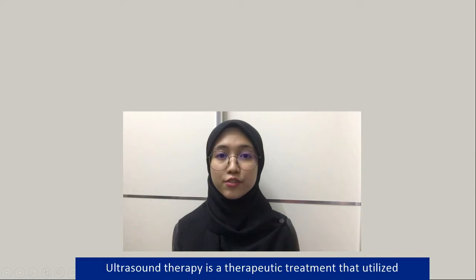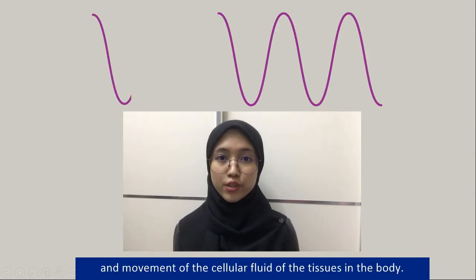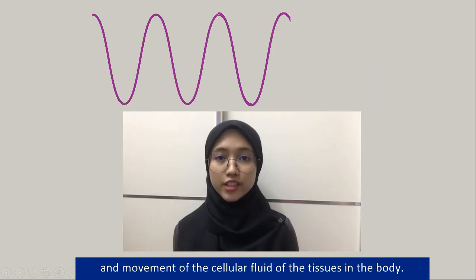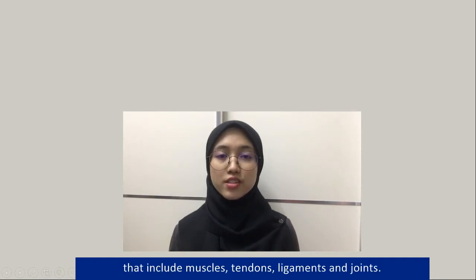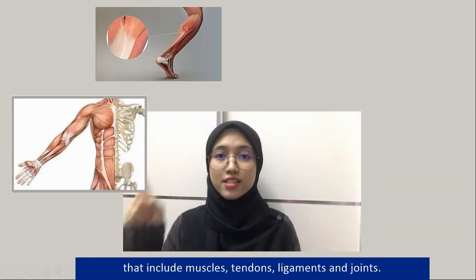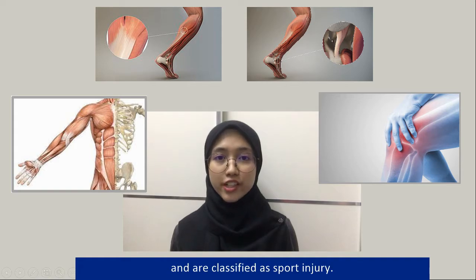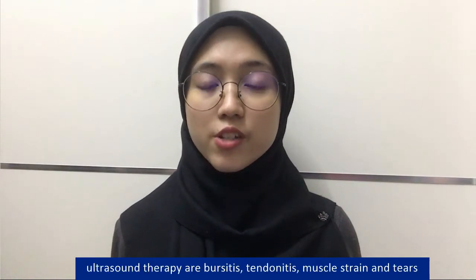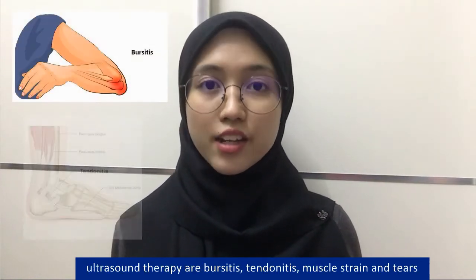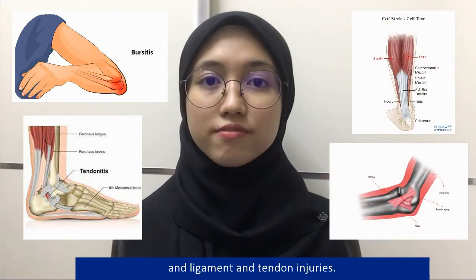Ultrasound therapy is a therapeutic treatment that utilizes high-frequency sound waves that cause vibration and movement of cellular fluid of the tissues in the body. Mainly, ultrasound therapy is used to treat injured soft tissues that include muscles, tendons, ligaments, and joints. These injuries are usually experienced by athletes and are classified as sport injuries. Examples of soft tissue injuries that can be treated using ultrasound therapy are bursitis, tendonitis, muscle strain and tears, and ligament and tendon injuries.